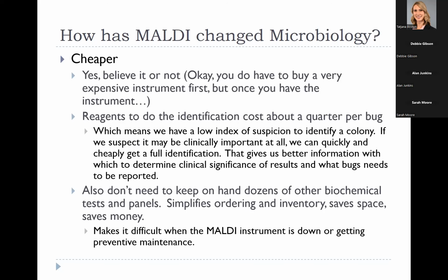Now this does include a lot of bugs that we've never even heard of. It's gotten me in trouble a little bit with some of our infectious disease doctors who call me up and say, you can't do this. You can't just name this bug. Because they walk into a patient's room and the patient says, oh, look, I've got this, or the hospitalist says, I've got this particular weird bug here. And the infectious disease doctor does the exact same thing the rest of us do, which is go to Google or PubMed and try to figure out what this bug actually means.